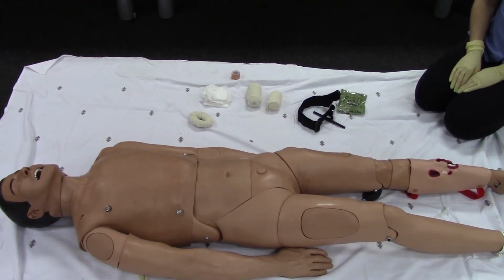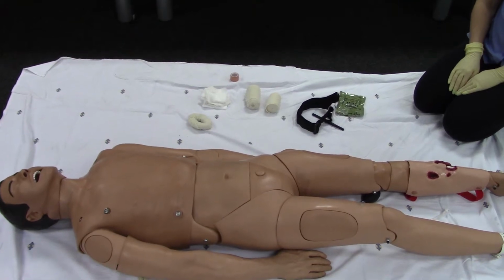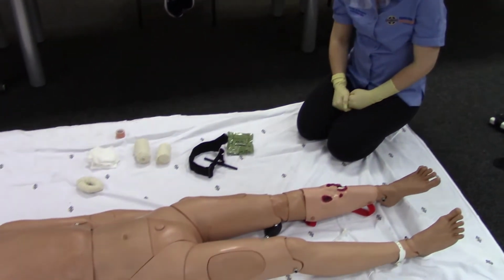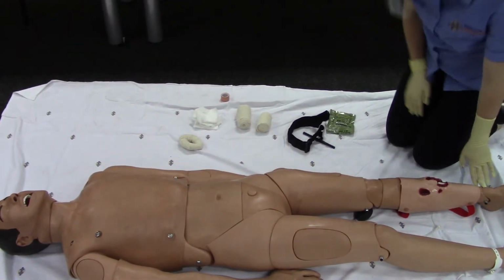Bleeding control and use of a tourniquet and topical hemostatic agents. Step 1. Wear appropriate protective clothing. Step 2. Explain the procedure to the patient. Hi sir, I'm going to address your wound on your leg.